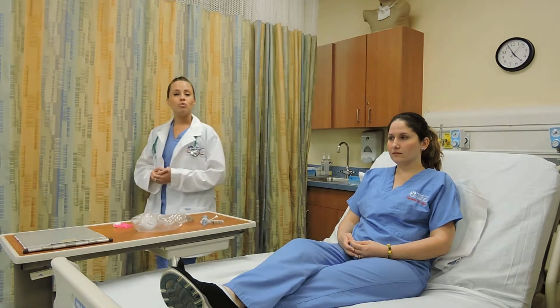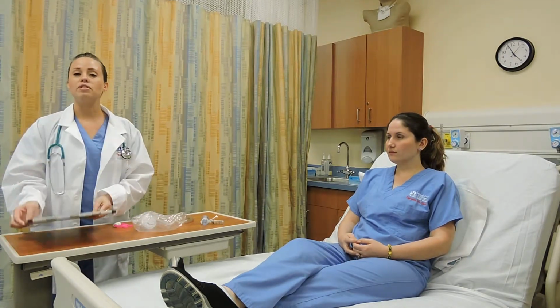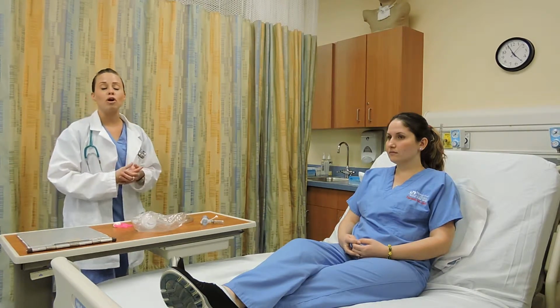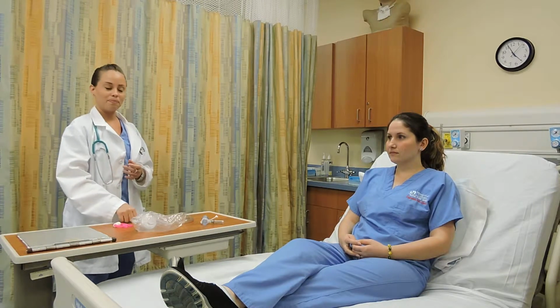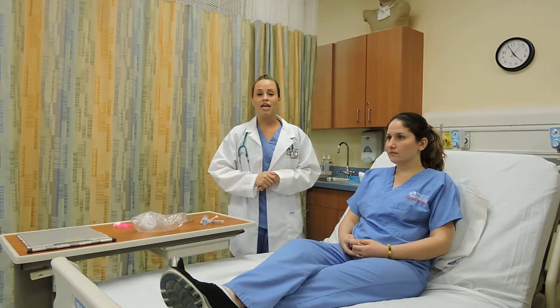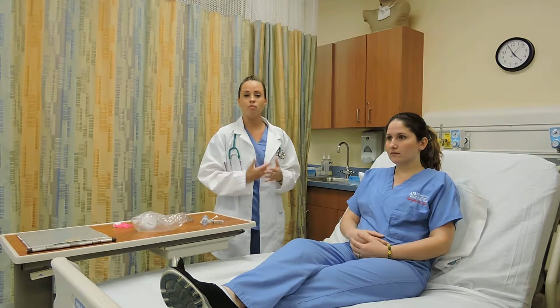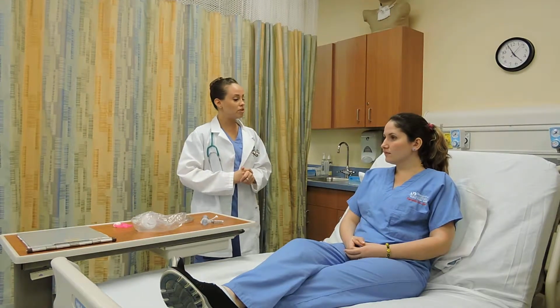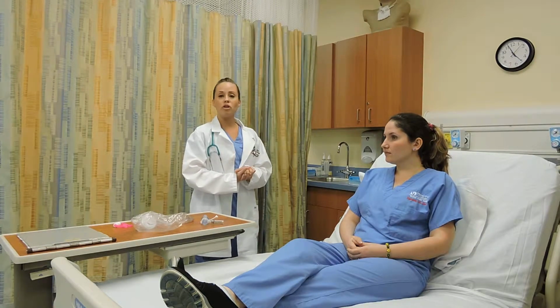First thing that I'm going to do to start the procedure is to check in the patient's chart for the physician's order of EzPap. Prior to coming to the patient's room, I'll make sure to knock on the door and wait for authorization to come in. I'll introduce myself as a respiratory therapy student and explain the nature of my visit in terms that my patient or his relative would understand. Hi, Ms. Sanchez, my name is Maria. I'm a respiratory therapy student, and I'm here today because your doctor ordered EzPap to help you clear out your retained secretions.